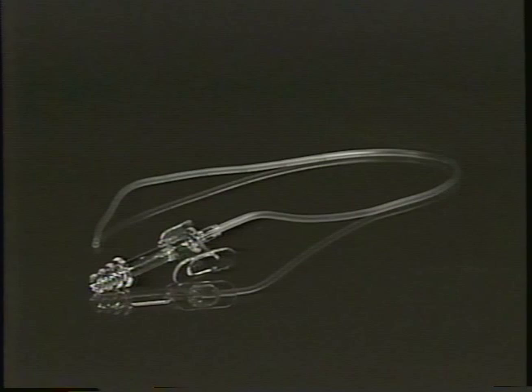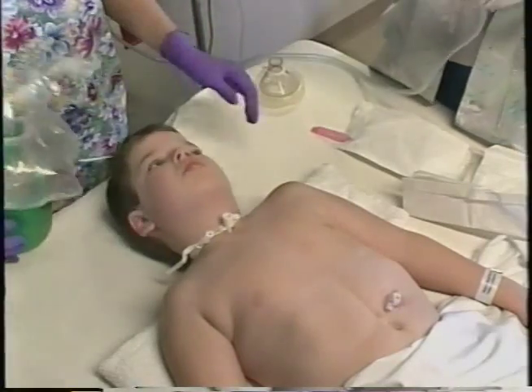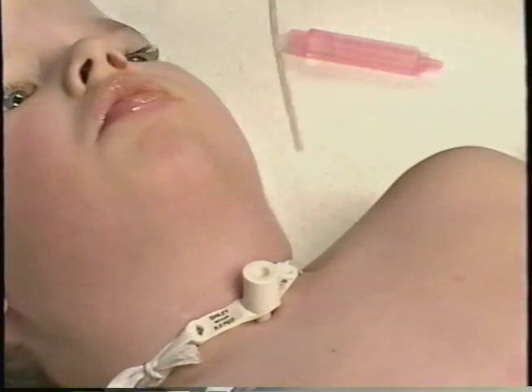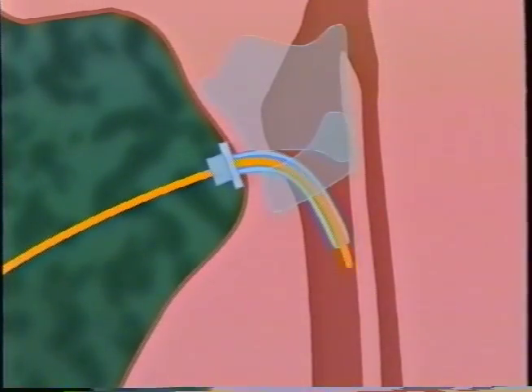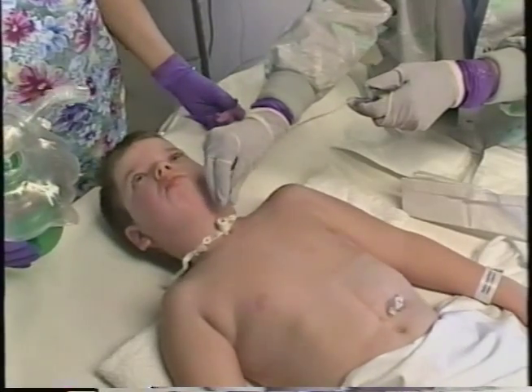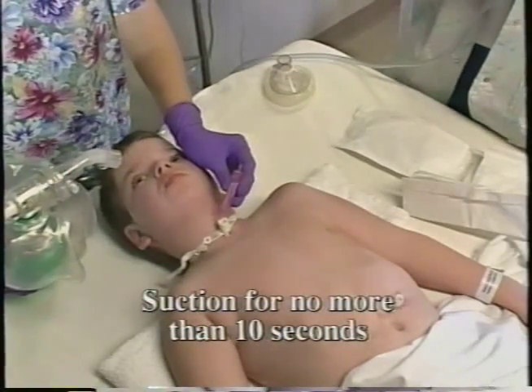Select a suction catheter that will fit through the child's tracheostomy tube. Typically, you will use a 6 French to 10 French catheter for this purpose. Disconnect and suction. Do not exceed 100 millimeters mercury vacuum pressure. For routine suctioning, insert the suction catheter no further than the length of the tracheostomy tube. Passing the suction catheter beyond the distal tip of the tracheostomy tube could cause trauma to the wall of the trachea. With the catheter between your fingers, use a twisting motion to suction all sides of the tube while gradually withdrawing it. Suction is applied for no more than 10 seconds.